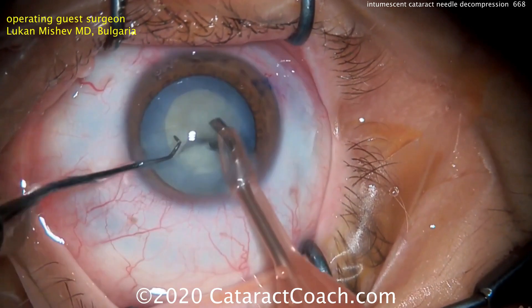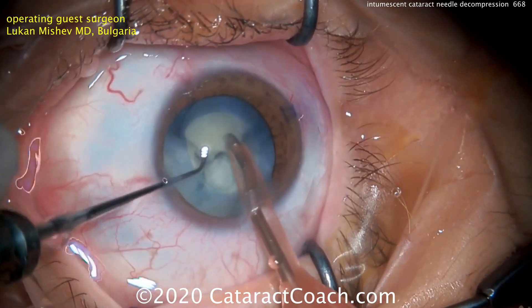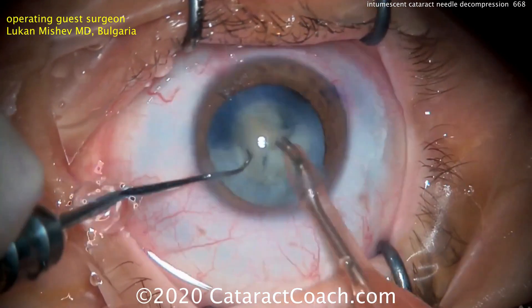You can also see the curvature of that chopper which facilitates this specific technique, and that instrument is available for purchase and is named after Dr. Mishev. The nucleus is split into many pieces and all we do now is simply remove the pieces.